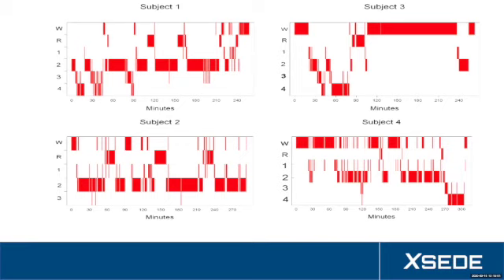Okay, those are the 4 hypnograms. They're plotted somewhat inversely compared to the sleep medicine paper, but you can see that they look very, very different. At the top of each is waking. And then it's REM sleep, and then stage 1, stage 2, stage 3, and stage 4. This is a more common way that the hypnograms are plotted these days.